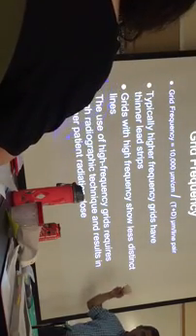So in both cases, the higher the ratio or the higher the grid frequency, you have to increase technical factors. It's kind of a direct relationship. Maybe directly related, yes, but proportional, no. In both cases, if you increase the ratio or the frequency, you're going to typically increase the technique, and underline that word typically, because you could also create grids that have a high ratio with low frequency, or vice versa. You can create high frequency grids with low ratios. You can create them in many different ways.